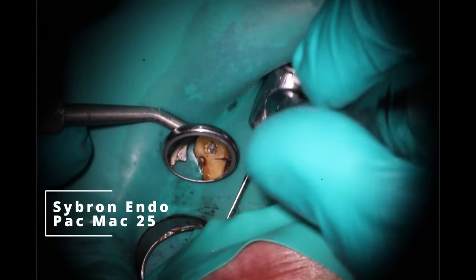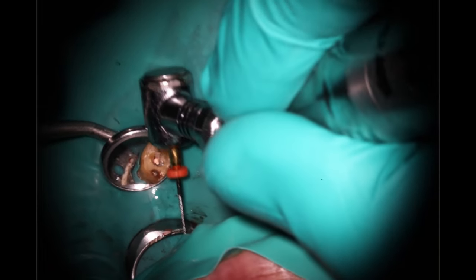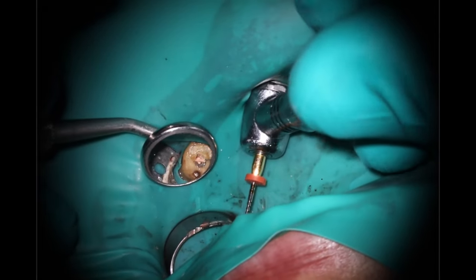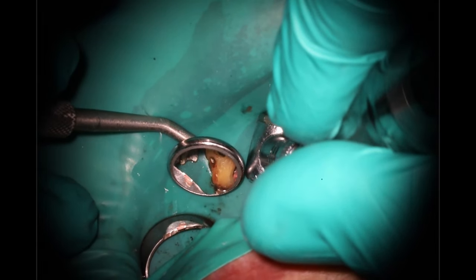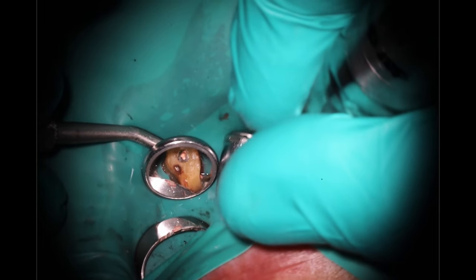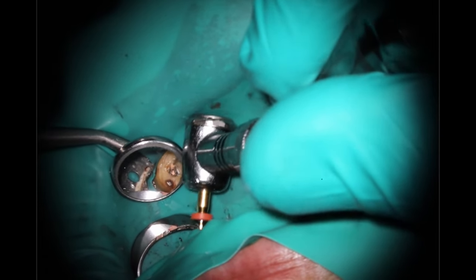I had talked to this dentist and he said not to worry about doing the buildup — he's an extremely talented dentist. He saw his mother-in-law the next day. So I'm not concerned about doing sponge and cavit and calling it a day. I did do something kind of interesting though — we'll show you that in a little bit. So at this point, we're going to be using the PACMAC just to condense any voids inside here. It's a reverse-threaded Hedström that just apically compacts the gutta-percha. And you'll see here that it did pull up a little bit of the material from the distal buccal — but you can kind of brush it on the way out and push any gutta-percha that's stuck on there back down apically.